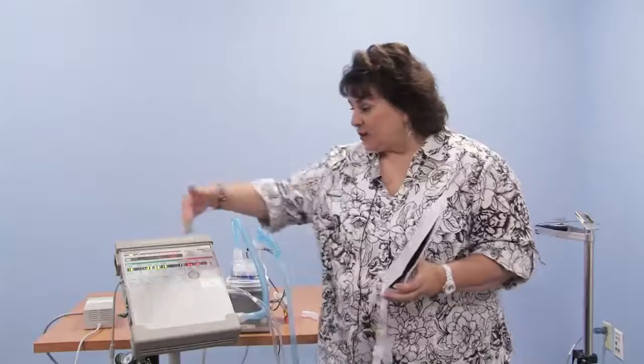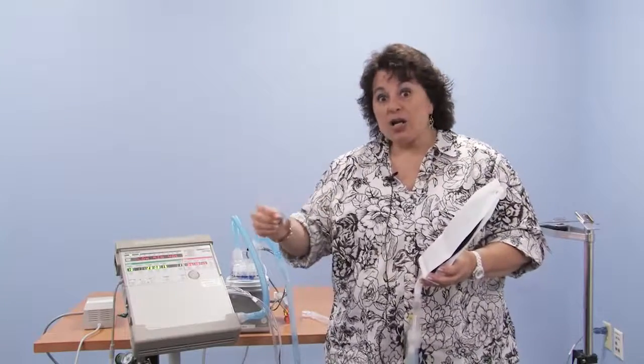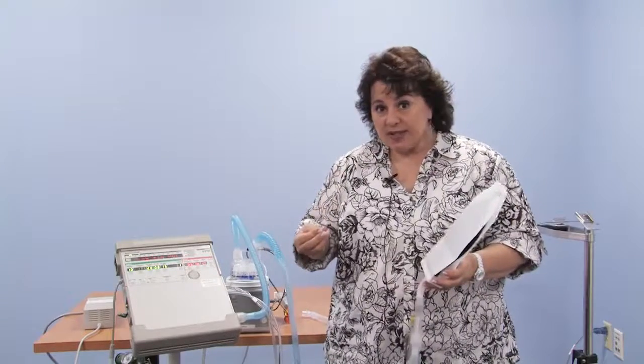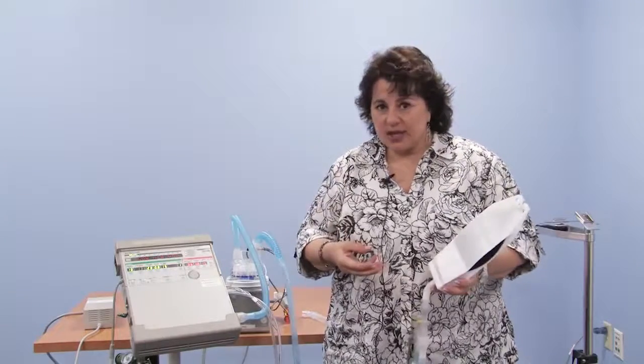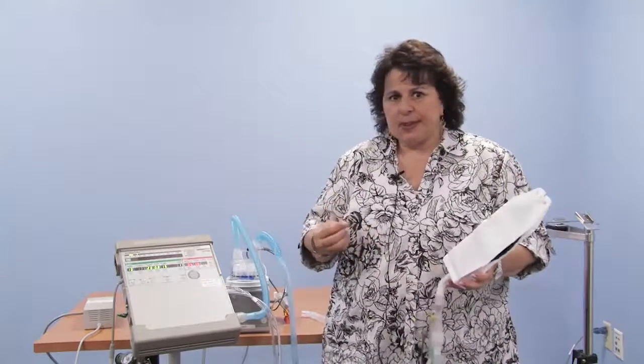We've talked about the fact that we can add oxygen to the machine right here on the oxygen inlet. It will be by liters per minute, and the more oxygen, the higher the concentration the child receives. You will know before you go home, or whenever ventilation is initiated with the LTV, how many liters gives your child a saturation that is normal for them, typically 92 to 95%, but it depends if they have heart issues or not. But whatever the doctor's recommended amount of oxygen saturation that you look at with your monitor, you will bleed in the amount of oxygen your child needs.